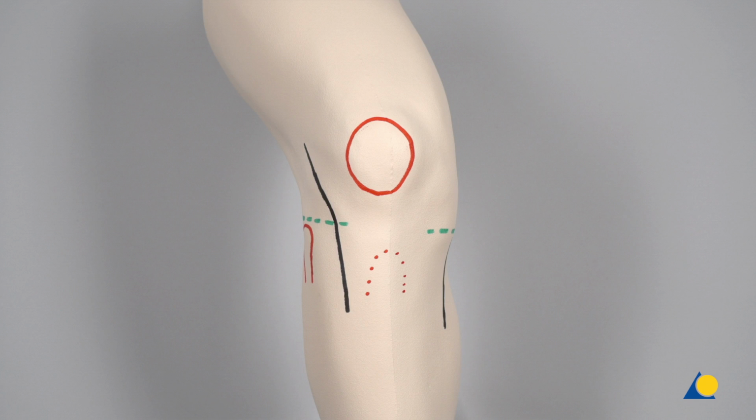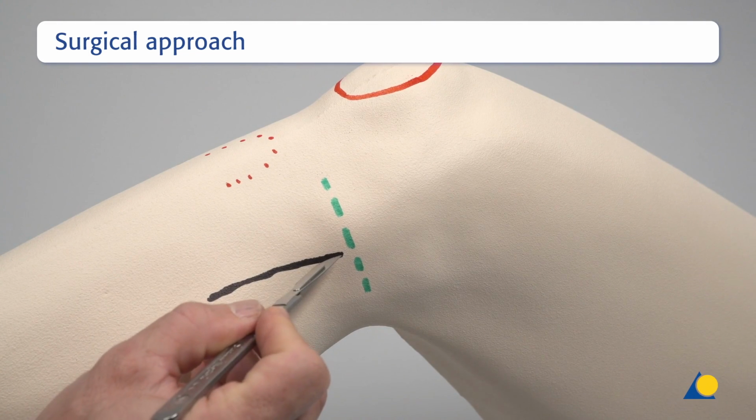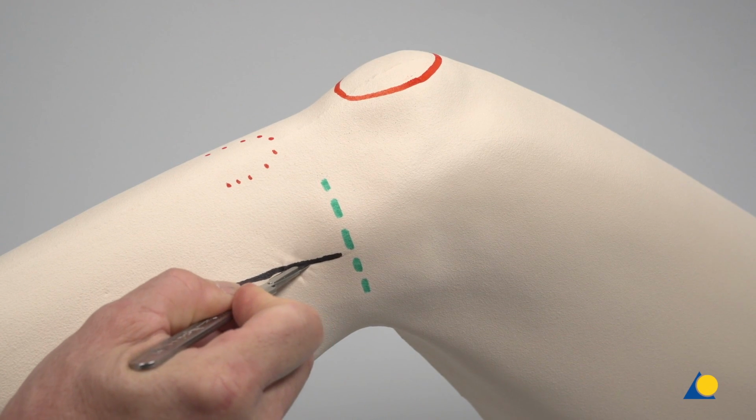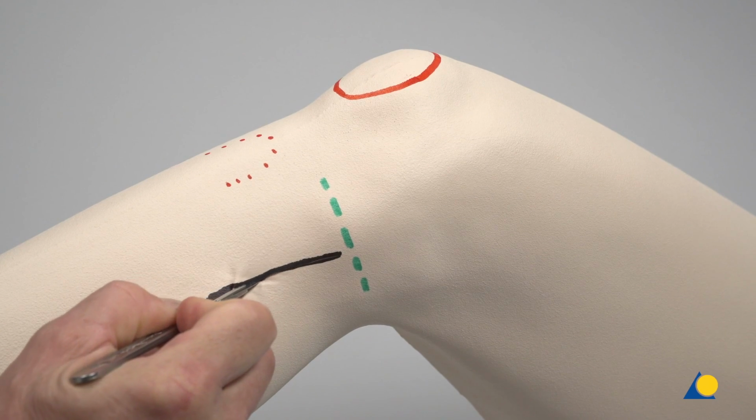In the clinical situation, care is taken to achieve the widest possible skin bridge with the minimum possible undermining. The medial incision is directly dorsal to the pes anserinus, which is elevated or partially incised depending on the fracture configuration.